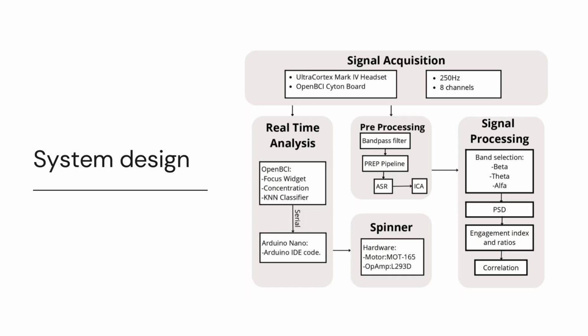The prototype employed the OpenBCI Cyton board and Ultra-Cortex Mark IV headset to capture EEG data via an 8-channel setup following the international 10-20 system. These signals, sampled at 250 Hz, were transmitted through serial communication to the OpenBCI software for processing. Real-time analysis utilized the focus widget algorithm, employing classification models to gauge concentration levels.